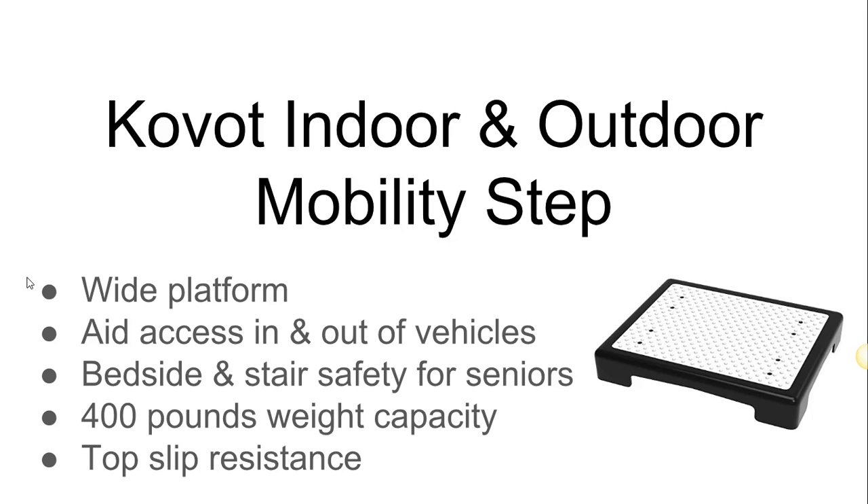In this particular video, we're going to look at a mobility step. What this step does is it aids the elderly and children from getting out of cars, coming down off a bed or a step, or when they're trying to get up a step.